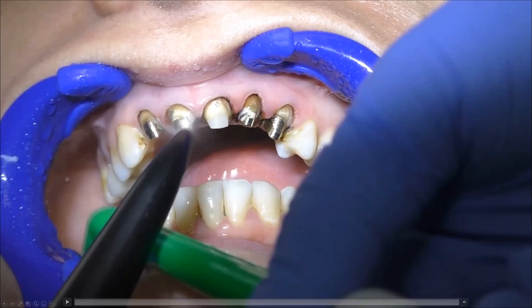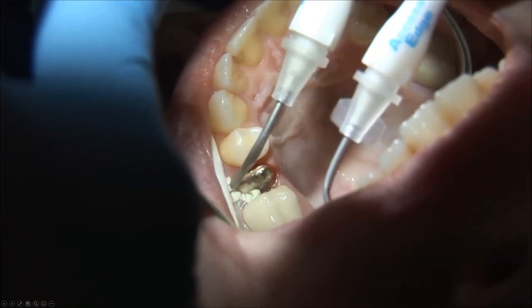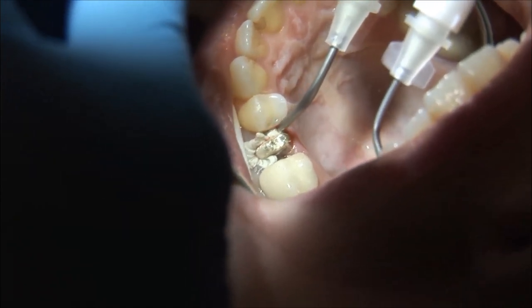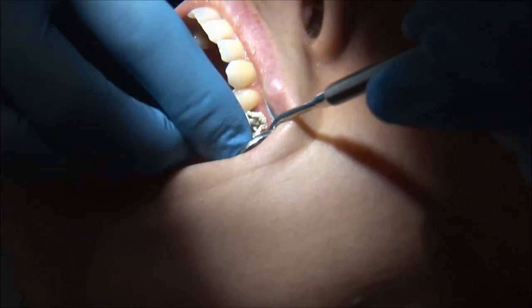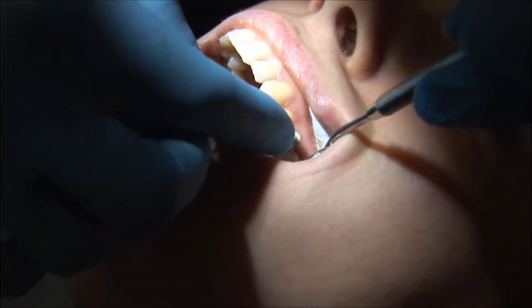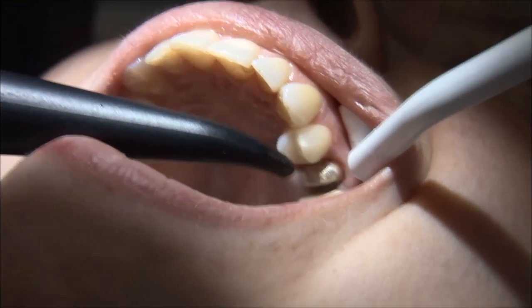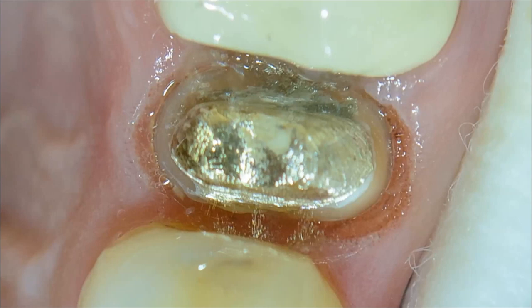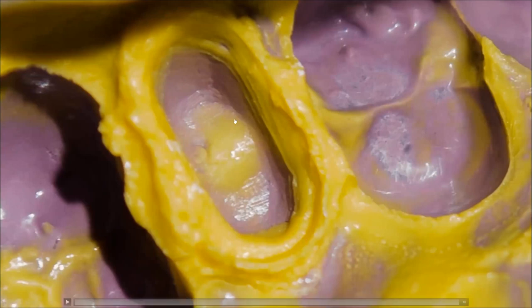Here it's a double cord technique because we have a subgingival margin. I place a double zero retraction cord, and instead of placing a second retraction cord, I use Access Edge as the second cord. In another case, I will not use a retraction cord at all — only Access Edge. After preparing the tooth, place Access Edge, then place the gingival cap and ask the patient to bite. You also get mechanical retraction in the apical direction from the biting force. You can clearly see the margin in the impression without using any retraction cord.